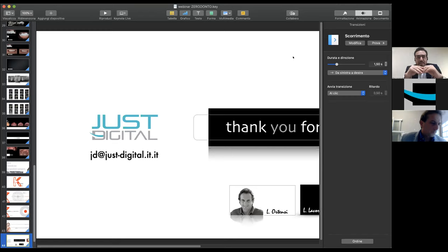So in English, Luigi Guida asks if it is necessary to have an intraoral scan before putting the patient in the radiographic device for the CBCT. It's not necessary because, for the prototype for an edentulous patient, we already have all the clinical data of the patient. For realizing the prototype in the patient's mouth, we have already done an intraoral scan or an analogic impression and digitalized it. So you just put the patient into the radiographic machine, and then you send the prototype and the Evo Byte, the radiographic referral, to the production center for having the surgical template.